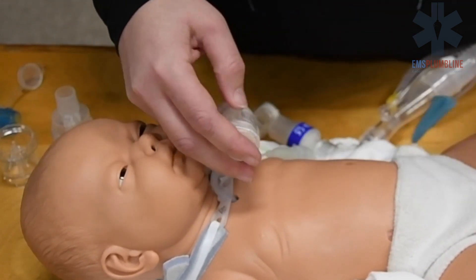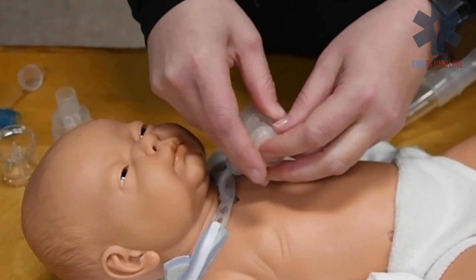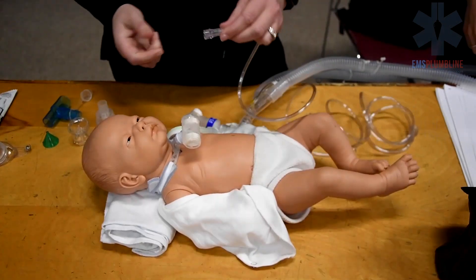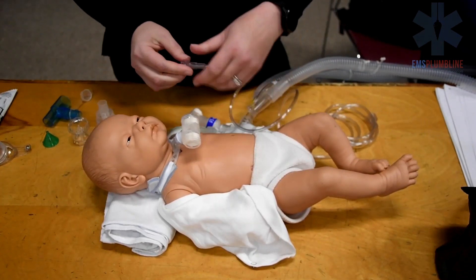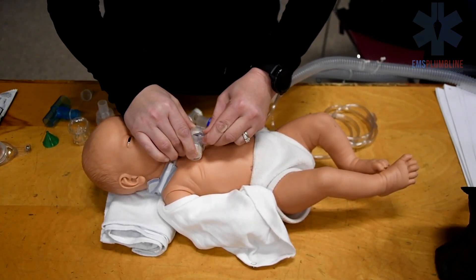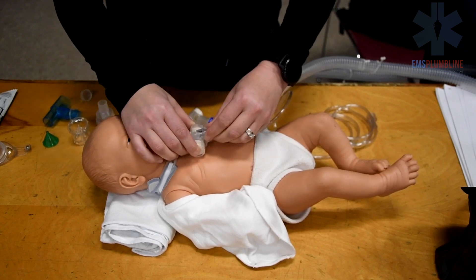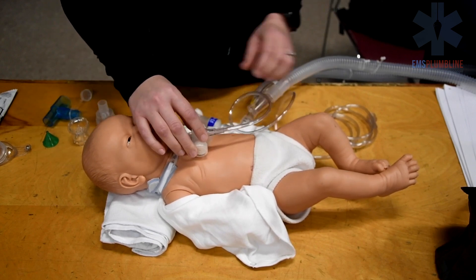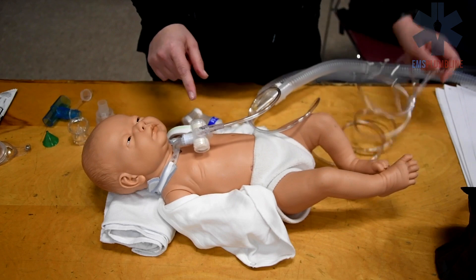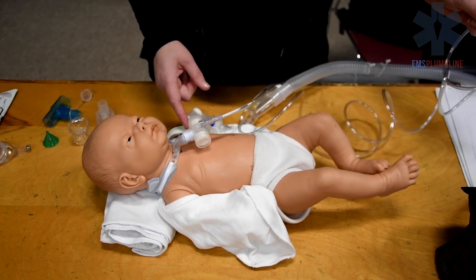Another method of humidification is a trach mask. This allows humidified air to be administered to the trach. Using the trach mask also allows for nebulized medication to be administered, such as normal saline. Normal saline can be helpful when secretions are very thick.